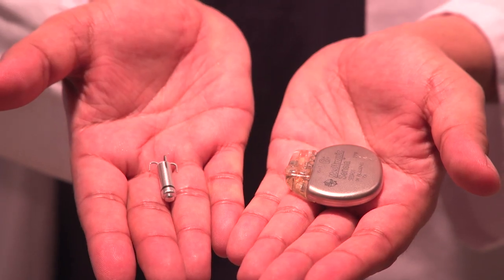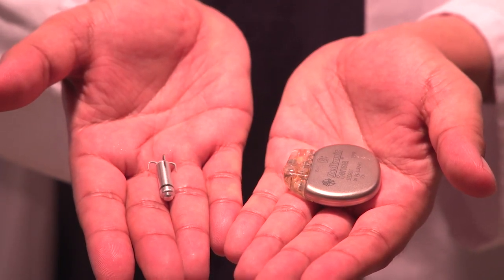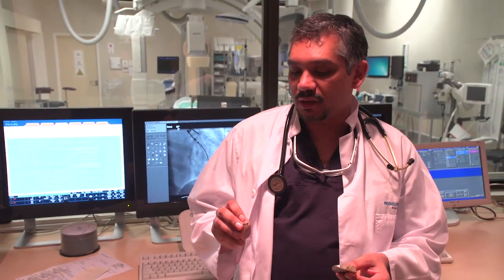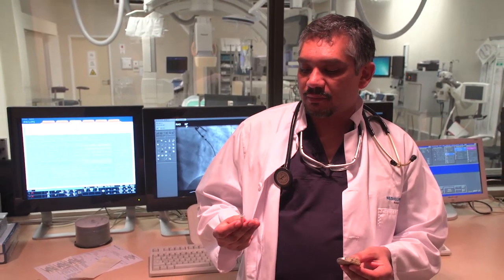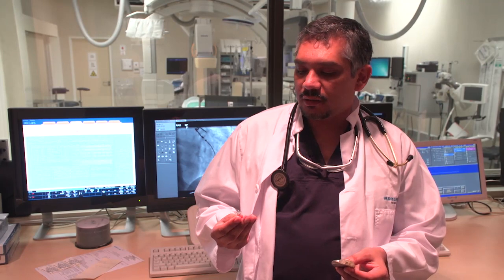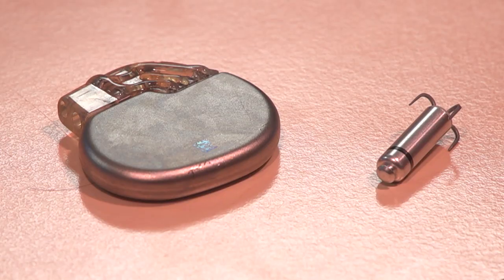On average, they're saying it's approximately 90% smaller than the original pacemaker, which is in my left hand. So this is a dual chamber pacemaker, and this is the current single chamber pacemaker, which we've just implanted, which is the Micra device from Medtronic. It is the only FDA-approved leadless pacemaker currently available in the world.